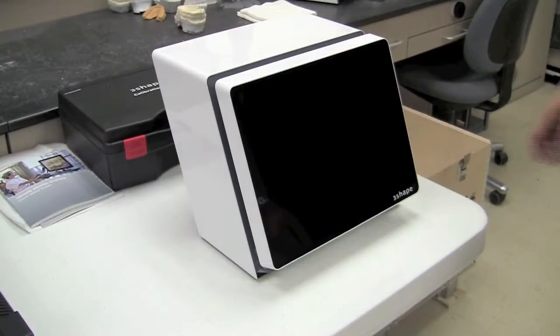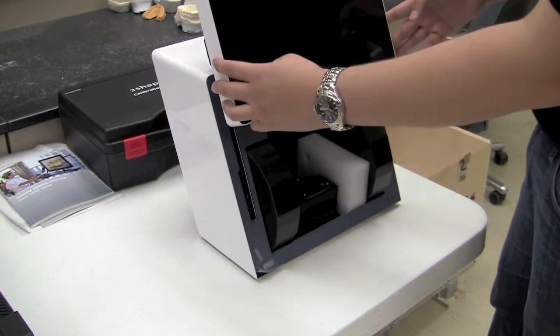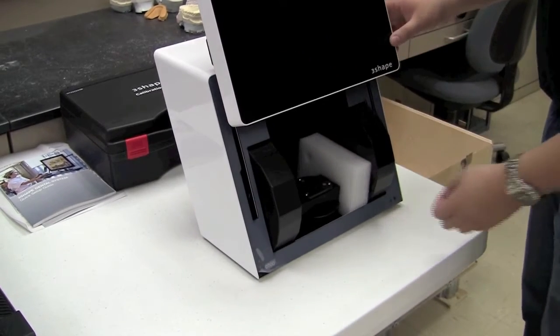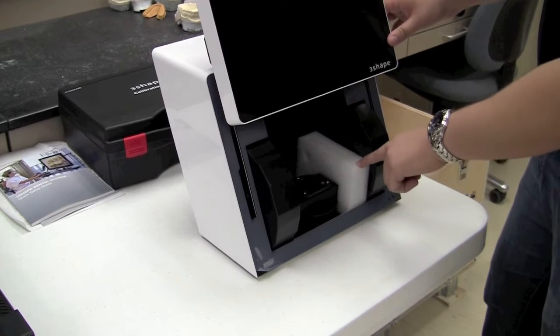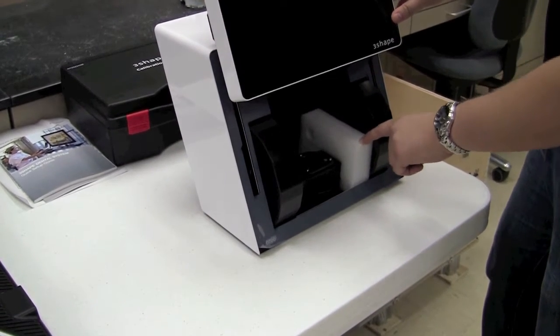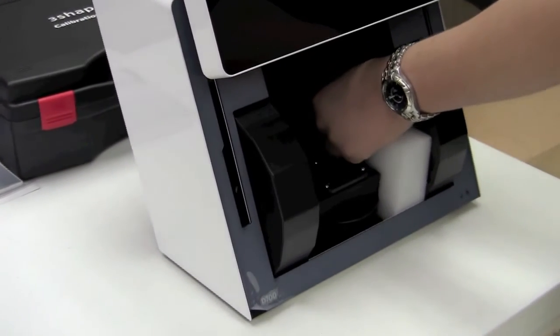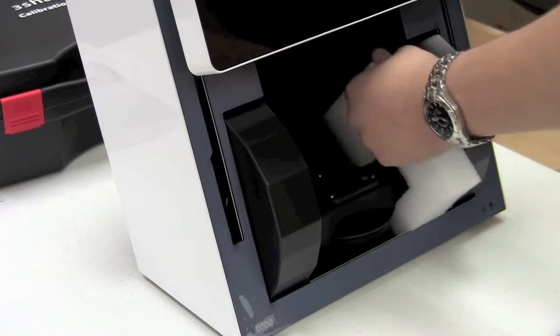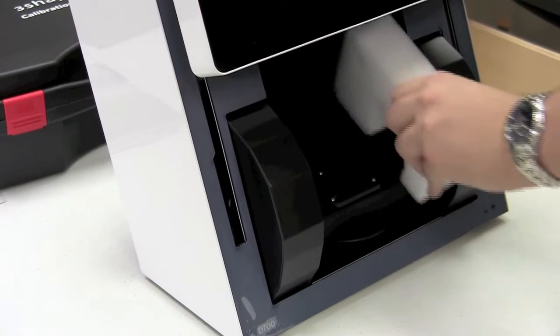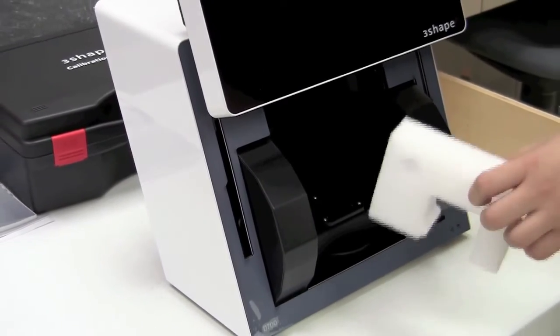The next step is to open the front door of the scanner. You can usually do this by pushing it straight up — it has struts that assist you in that. Inside, we're going to find a foam brace that holds the scanning table steady during shipping. Using the little finger hole in the back, place your finger in that hole and pull straight out, up and out. This removes the foam brace that holds it in place.